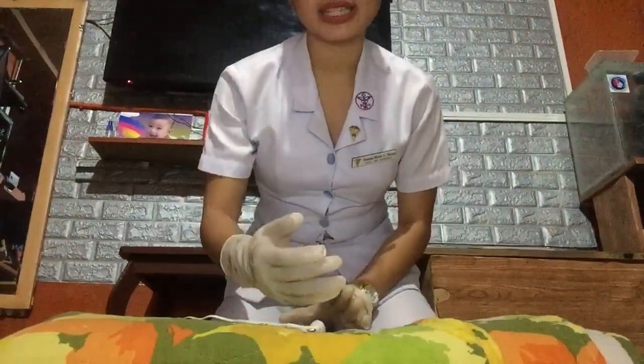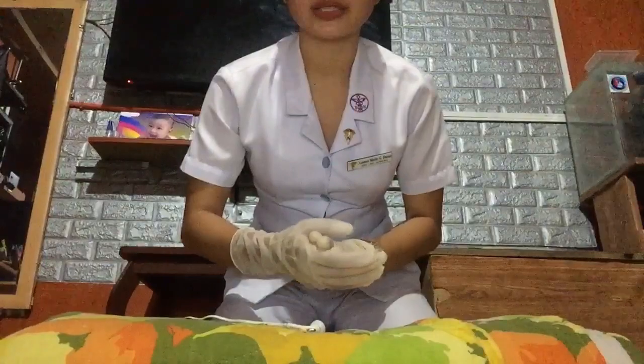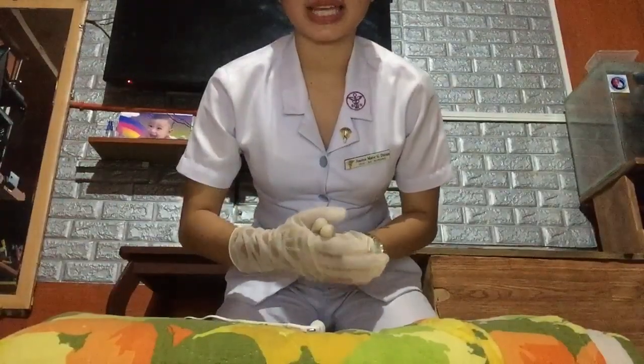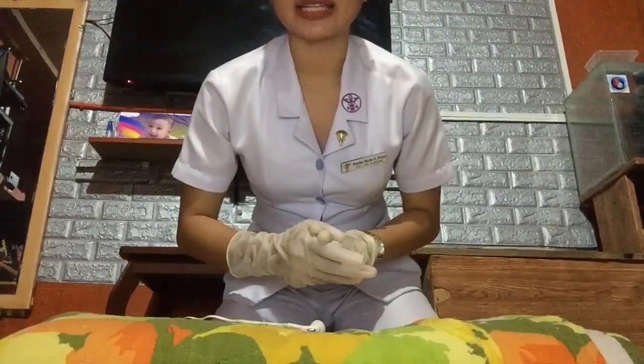After that, the AED will tell us to resume the 30 chest compressions and rescue breaths for a number of cycles. The AED will analyze the patient's heart rhythm again, and if necessary, it will deliver another electric shock.